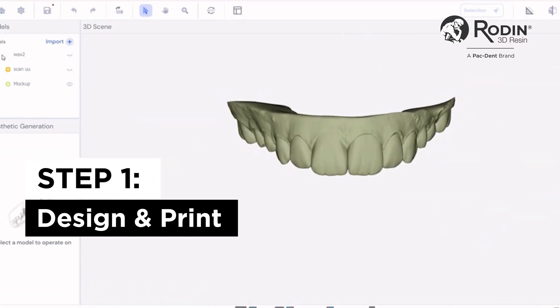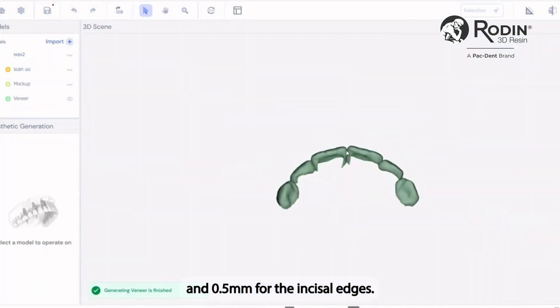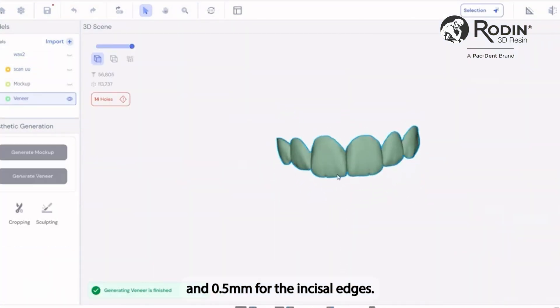In your preferred design software, create veneers with a minimum thickness of 0.2 mm for the anterior surfaces and 0.5 mm for the incisal edges.